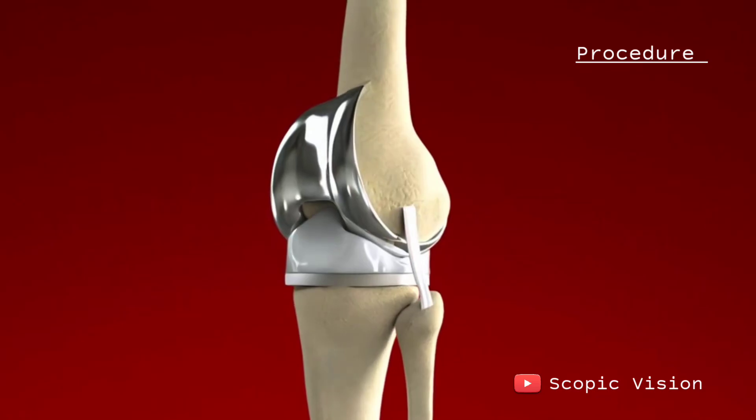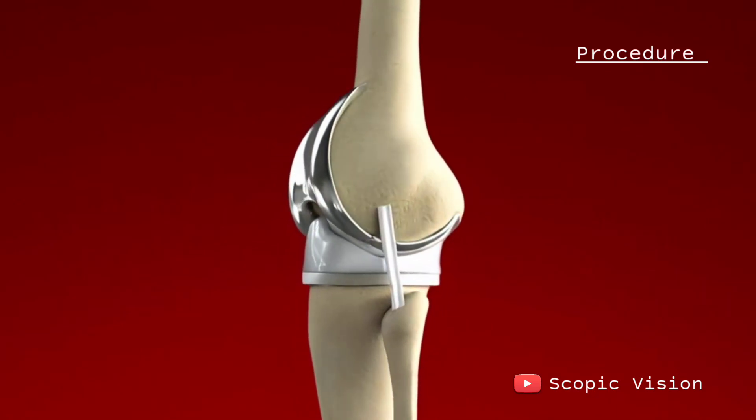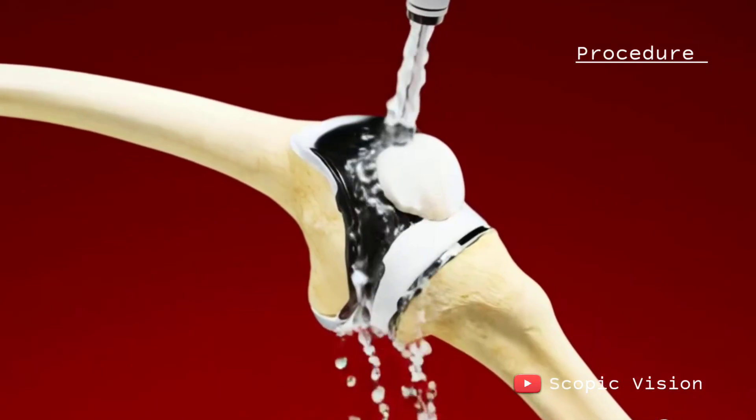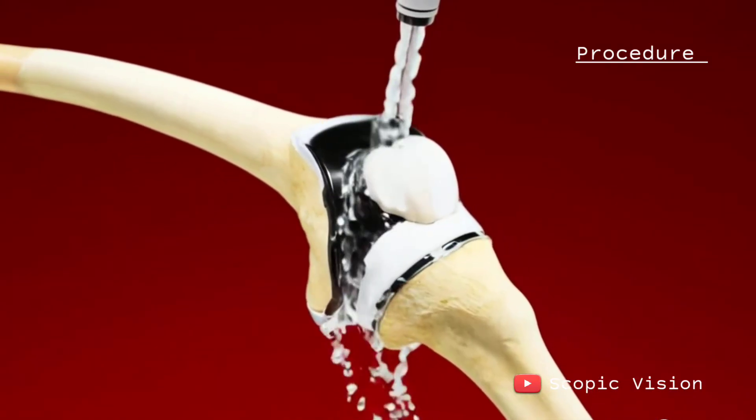Once all the components are in place, the surgeon tests your new knee's motion and alignment, making sure everything moves properly. Finally, before closing up, the surgical area is thoroughly cleaned with a sterile solution.